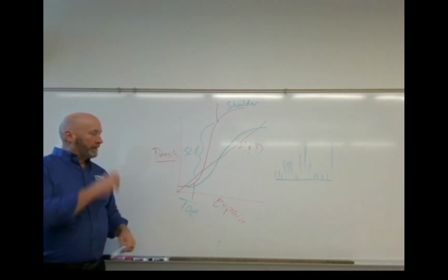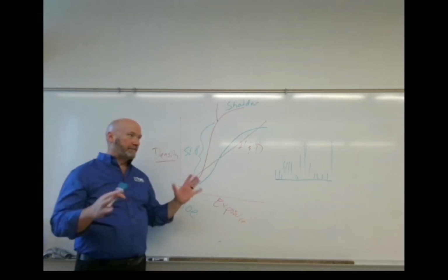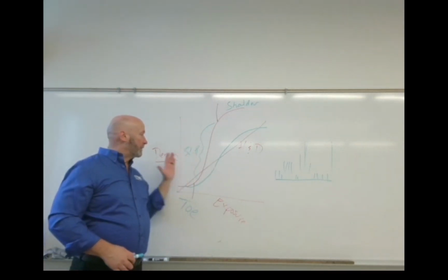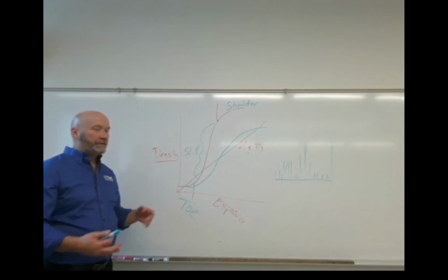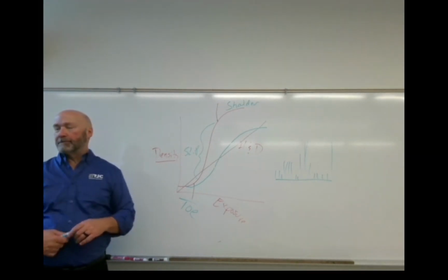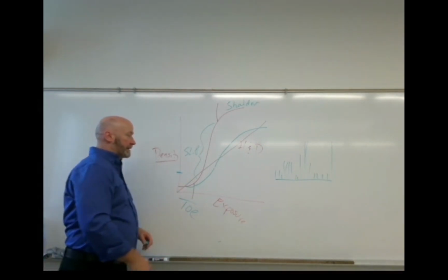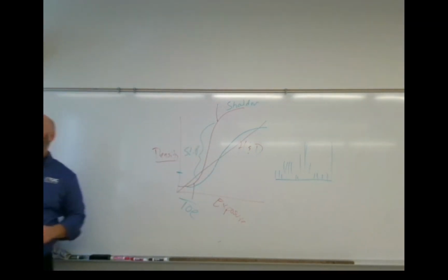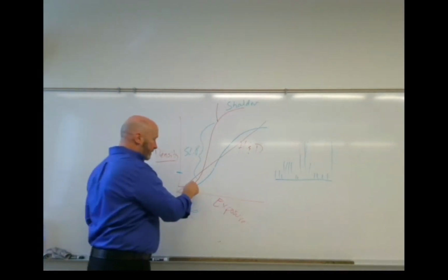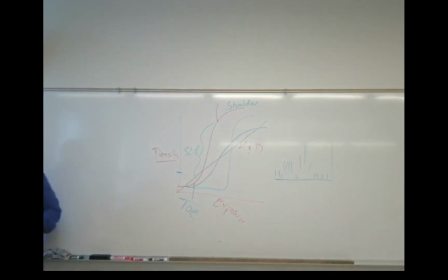That would be really the speed is a point, and it's irrelevant at this point. But really, whichever one's closest to the density axis. The full explanation or full answer to that would be at 1.0 plus base plus fog. But somewhere around this point right here, whichever one's closest to the density axis. And out of these two, the high contrast. And we can have high contrast, like mammo films look like this. Very high contrast, but very slow speed. Okay. Any questions?